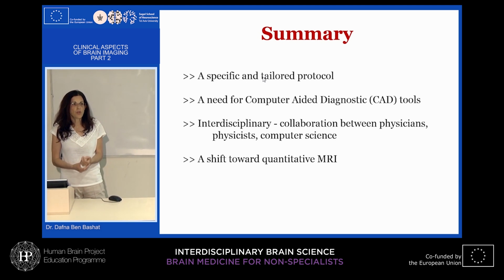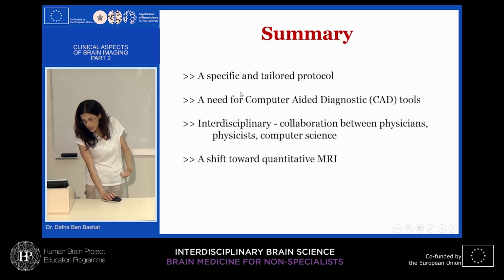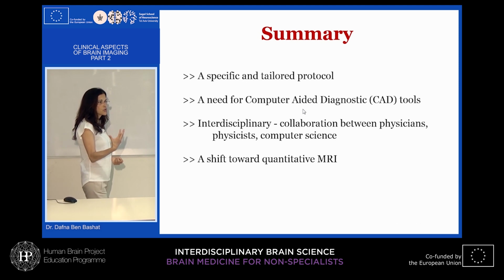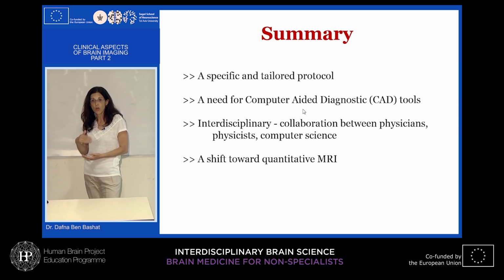Because we have a huge amount of data, in radiology we're talking about megatera of data. If we want to analyze things, a lot of it is supported by a CAD system. We do want, like you said, to help radiologists, so they have something that immediately transfers, comes back, and gives them at least some assistance, showing them that this area was changed, we suspect.